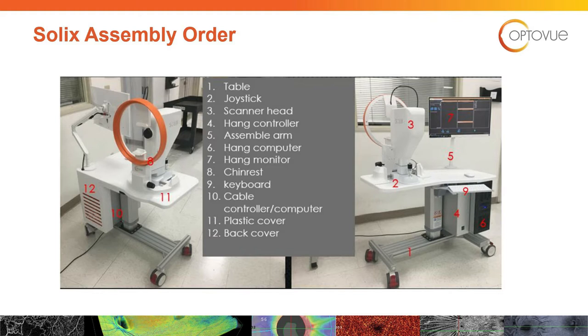Place the joystick assembly onto the rails and attach the covers. Lock the joystick down, then place the scanner head on top of the joystick and hang the control box.